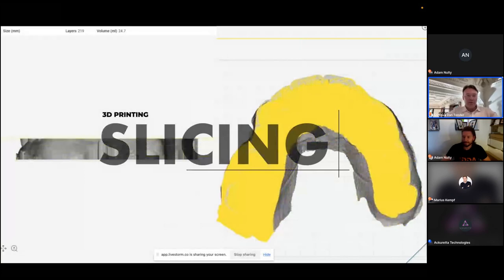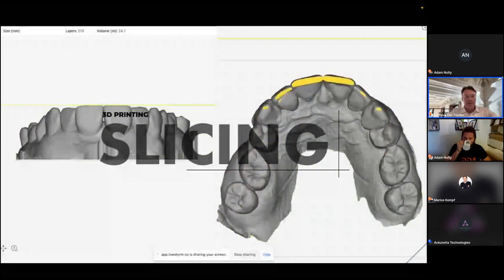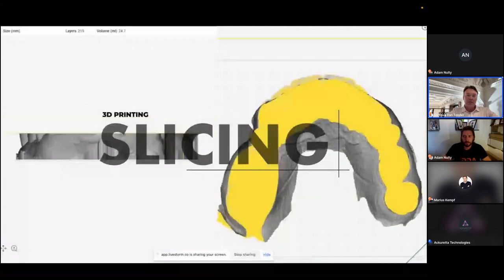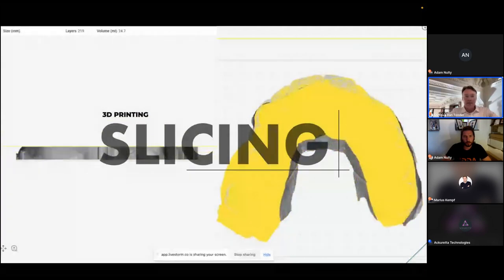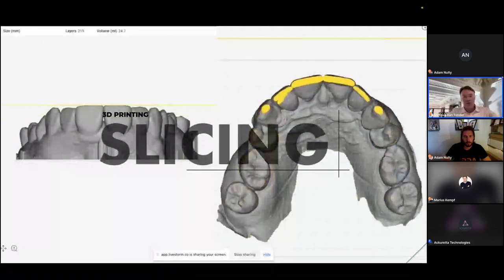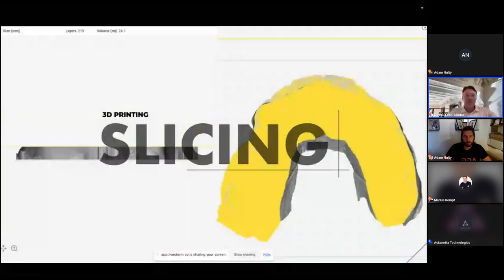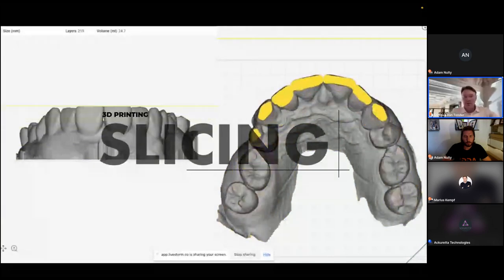Yeah, so once you have your solid file made, which can either be an STL or PLY, depending on the software that you've used for that, you need slices that will send this to the printer. So basically, the slicing software will take every increment that you've set on your horizontal thickness, which determines the accuracy of your print, and slice it into those, say, 80 micron or 100 micron thick slices, and that tells the printer what to print on each slice.